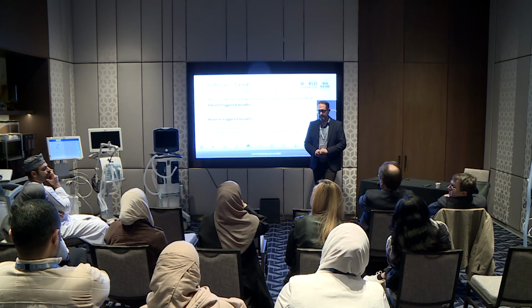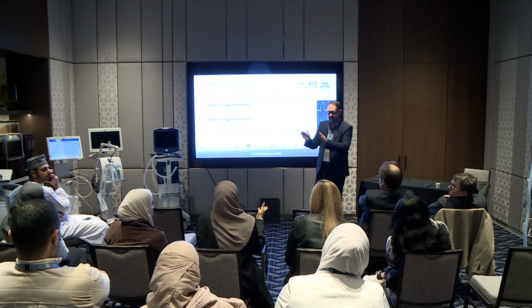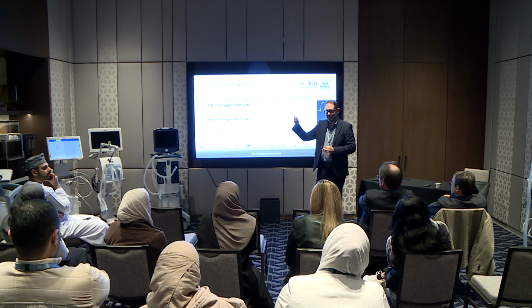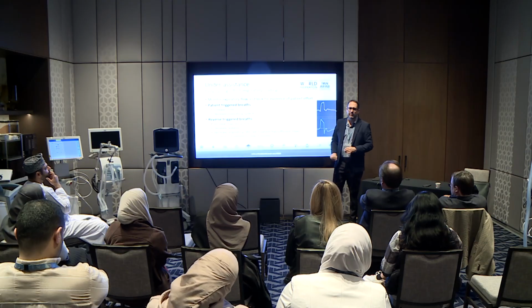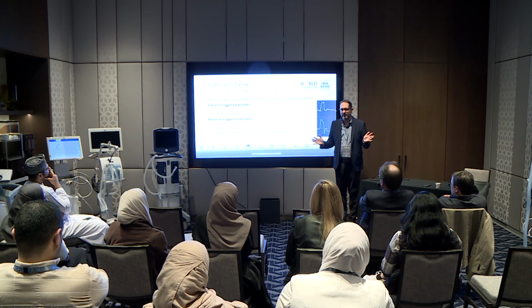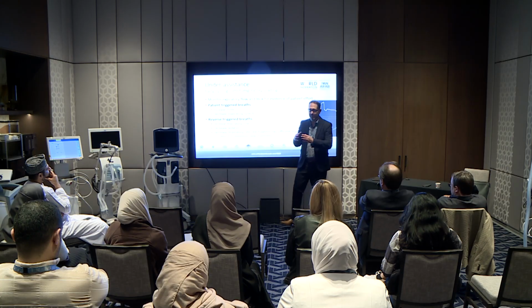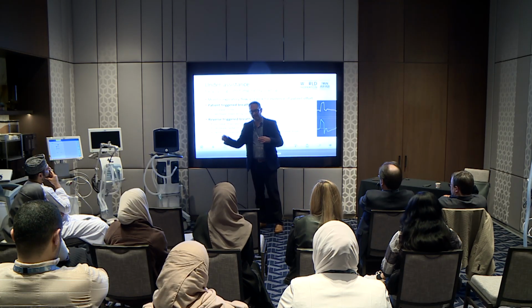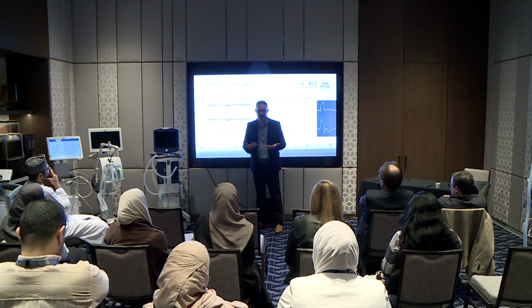What if we decrease the respiratory rate and their own respiratory rate is just higher? Then they'll start triggering the ventilator. Yeah. So here's the problem with reverse triggering. Some people will say just try to switch them to pressure support and see what happens. And what'll happen is you may have a long period of apnea, and then a breath, and then a long period of apnea, and a breath, and what happens? Your ventilator alarms. Me, I don't like my alarms going off, so I'll walk to the bedside.